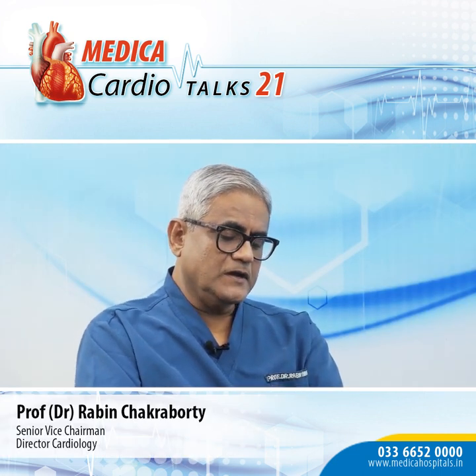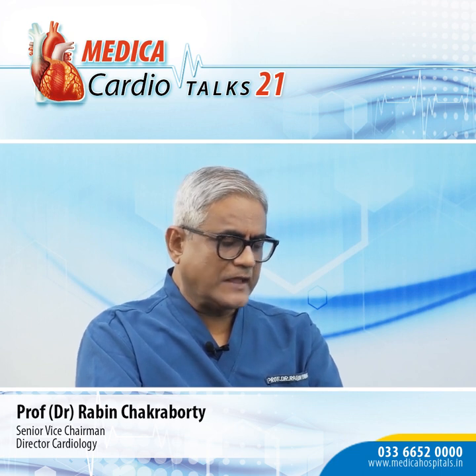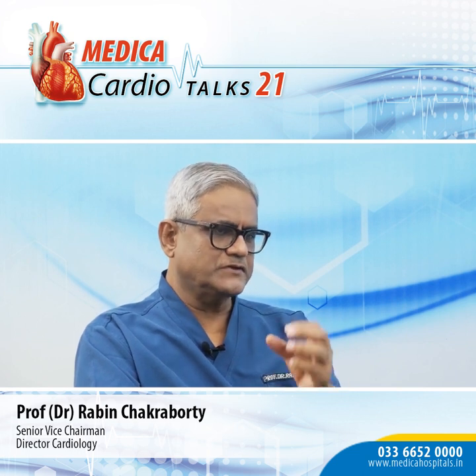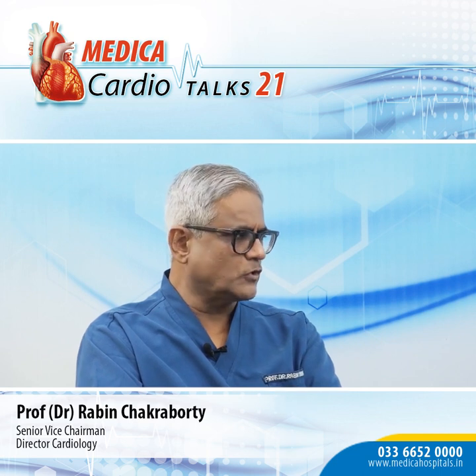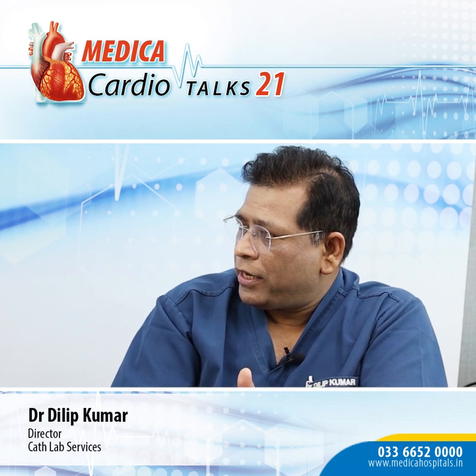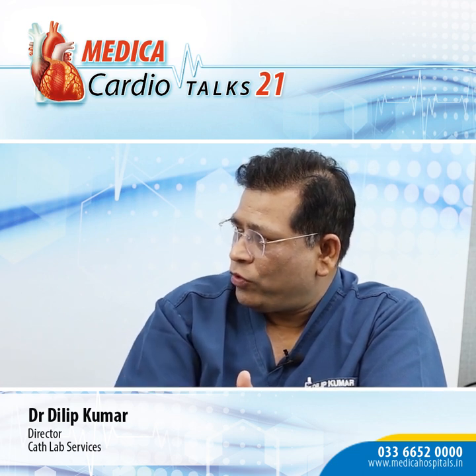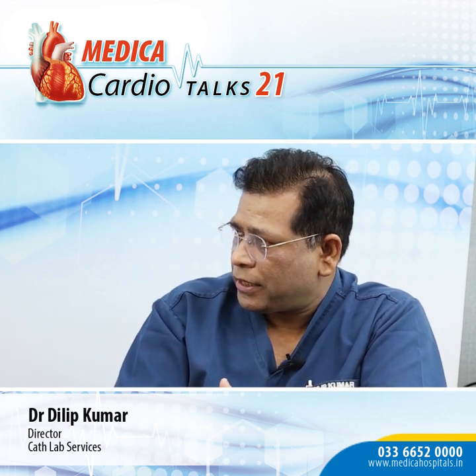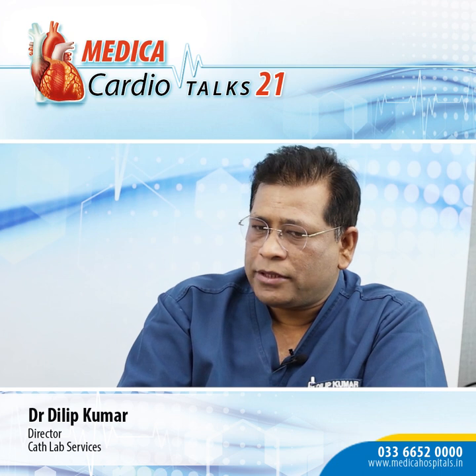Out of these different ways of doing it, first is what is called the TriClip, like the mitral clip. Second is the Cardioband, like a mitral or tricuspid annular band. Third is the valve, as you mentioned, probably at the level of the superior vena cava and inferior vena cava, and there are 2 or 3 more options. Devices which can occupy the central part, like a balloon-type device, a foam-filled device, on which the valve leaflets oppose and coaptation happens, which reduces the leak. But still, the results are not good.